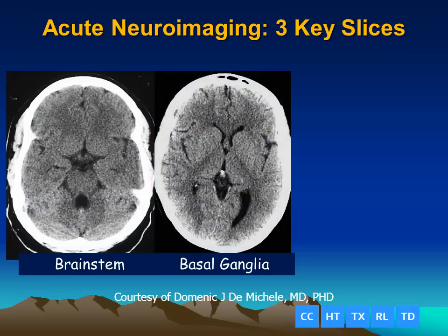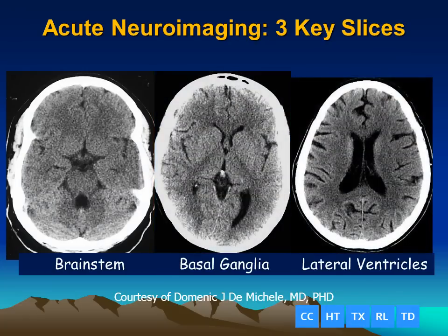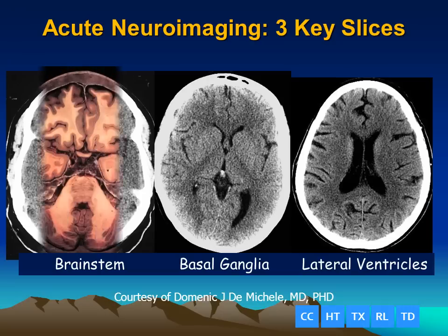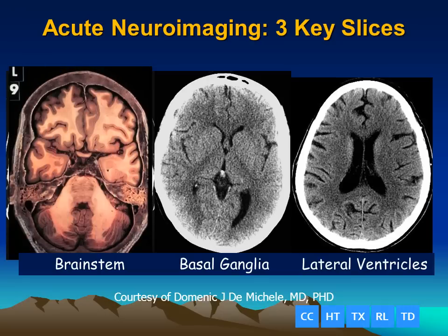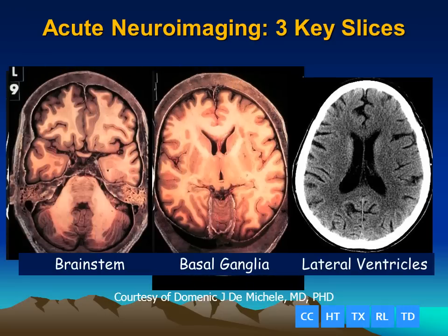The basal ganglia, and the level of the lateral ventricles. We should inspect these for the normal size and position of the ventricles, as well as visibility of the sulci, and the demarcation between the gray matter and the white matter.